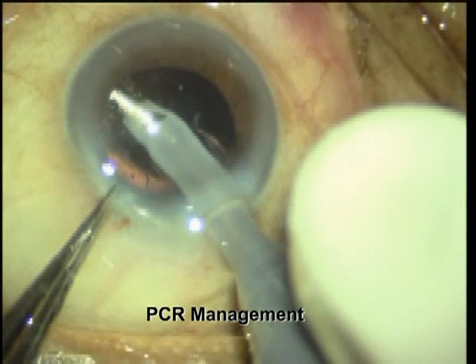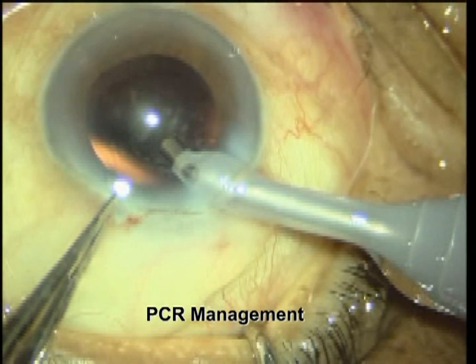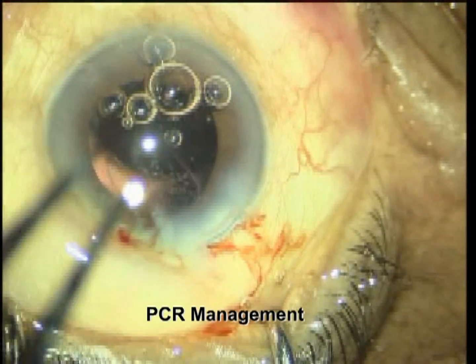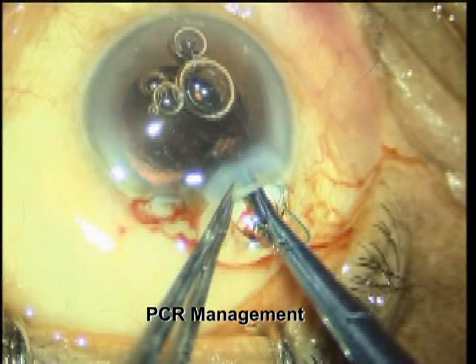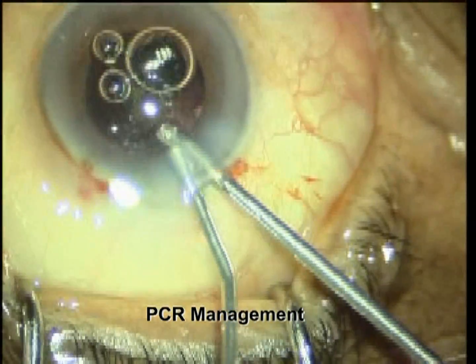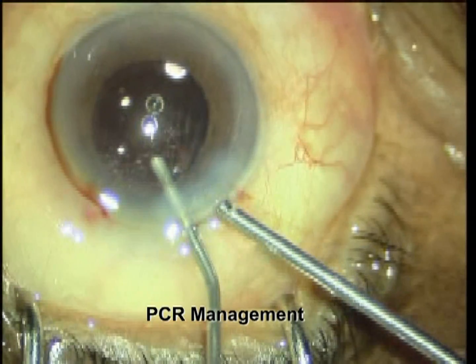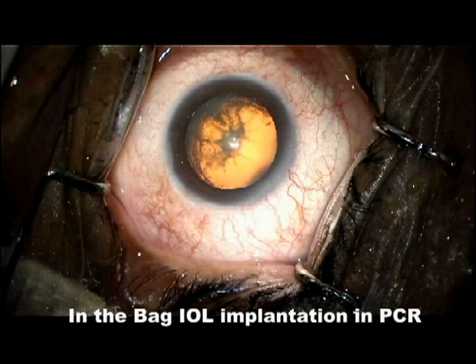Once the posterior capsule rent is present, here is how to manage it. In this case the posterior capsule rent was seen during cortical aspiration. We can see the posterior capsule rent, but since vitreous was not present in the anterior chamber, the intraocular lens was first implanted in the sulcus. Following this, localized anterior vitrectomy was done, and we can see a well-centred IOL.